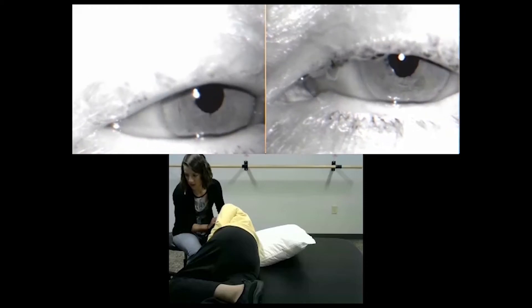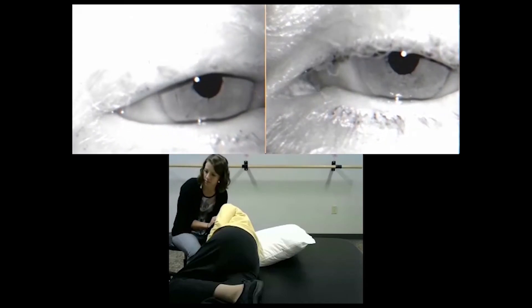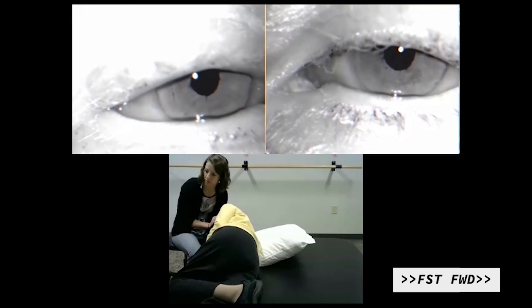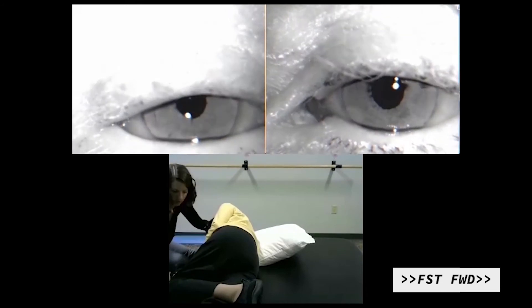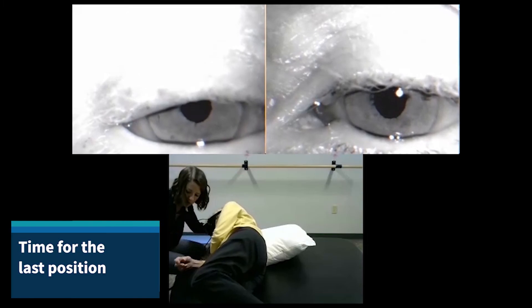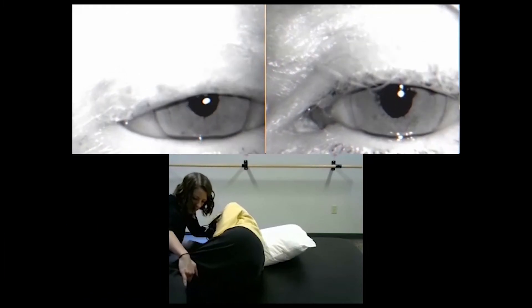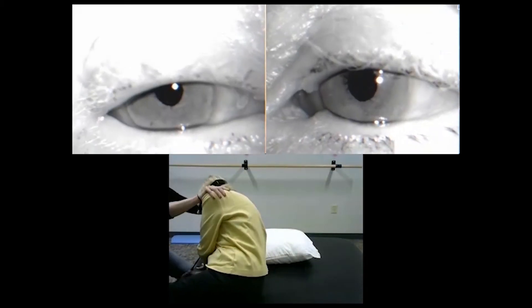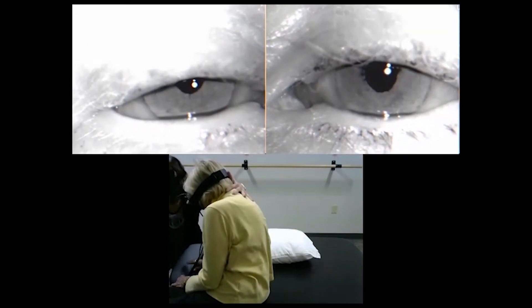We're going to wait about 30 seconds or so, and then we're going to sit up. You're going to keep your chin tucked to your shoulder. Drop your legs off the table towards me. We're going to sit up, keeping your chin tucked to your chest — keep your chin down.